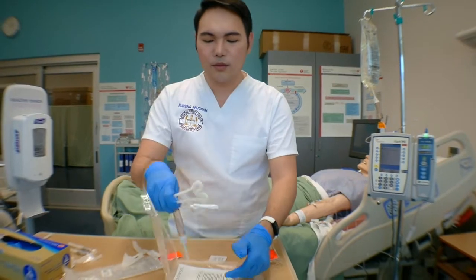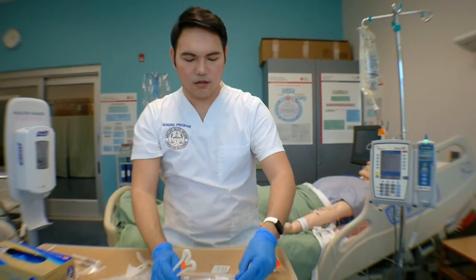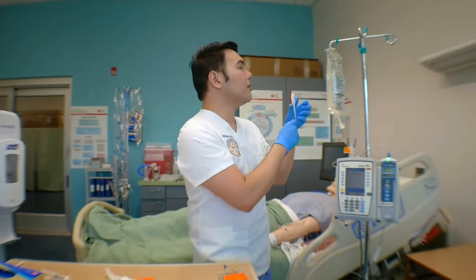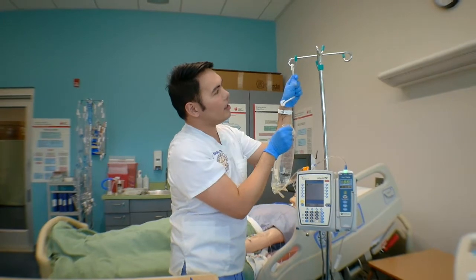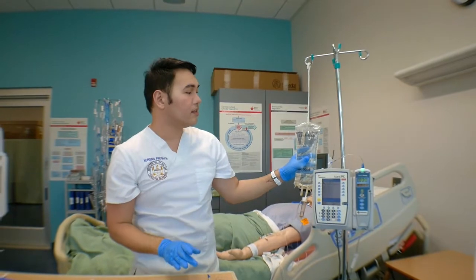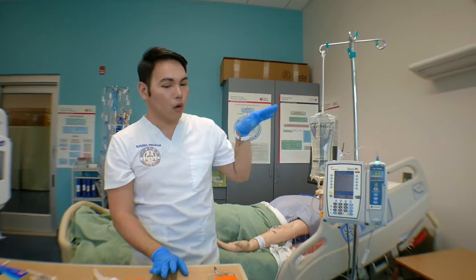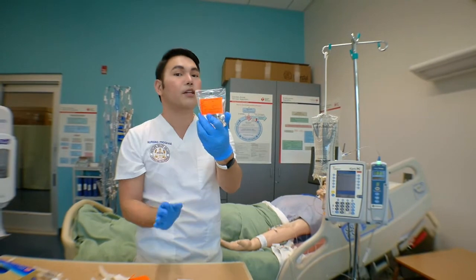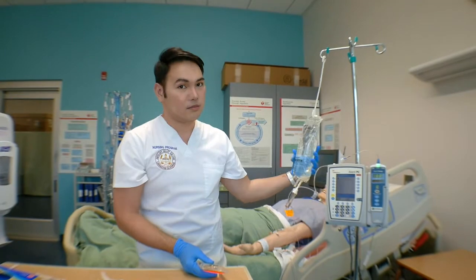So first thing I always do is clamp it. And so we have this hanger. The purpose of this hanger is for you to put your primary bag lower. So I'm going to clamp it like that. I'm going to put this lower. We're putting this lower because this is the heavier bag. So you want the heavier bag to go lower than your antibiotics, since you want this infusing first before your normal saline bag, which is obviously bigger. Okay.